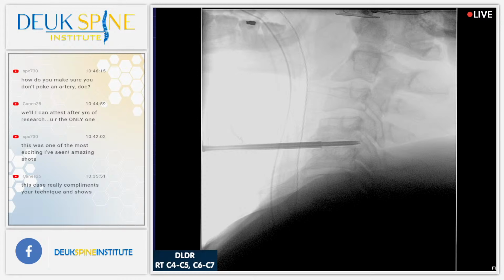Let's give a little distraction, guys. Ready? Yeah, I've been hoping you guys were doing it.